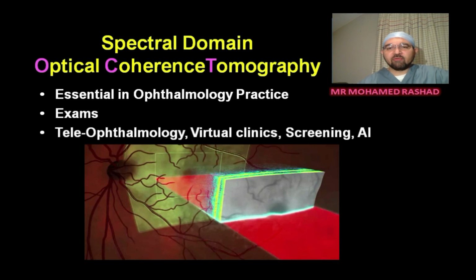And in the COVID-19 pandemic era now, we are changing into virtual clinics and tele-ophthalmology and screening and artificial intelligence. All of this needs imaging, and the most important imaging in the retina is the OCT scan.